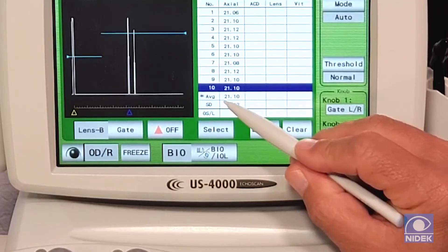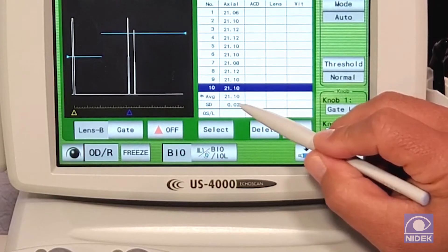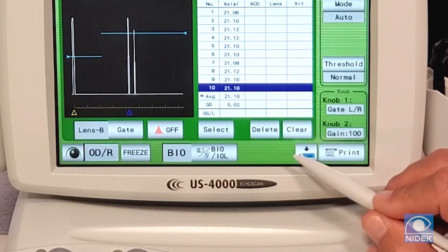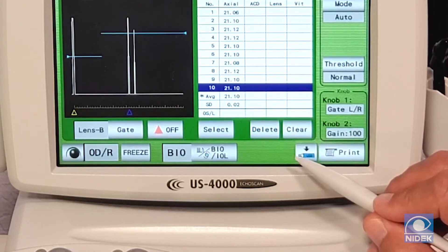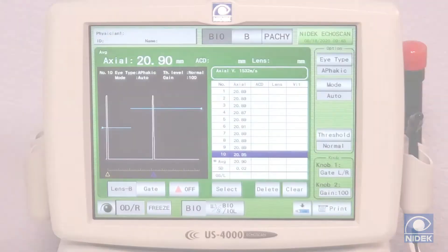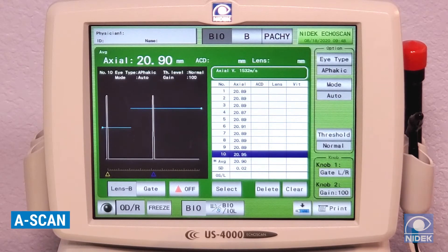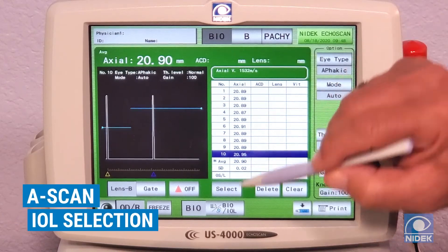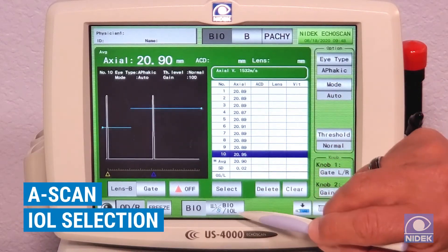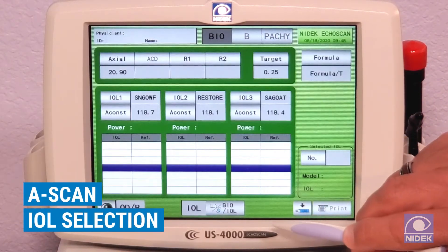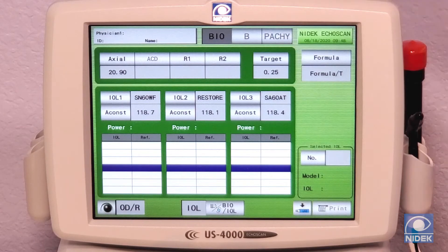We have an average of all 10 measurements of 21.10 and a standard deviation of 0.02. Now that we have completed our A-scan biometry measurement, we're going to go in and select an IOL by selecting BIO to IOL.